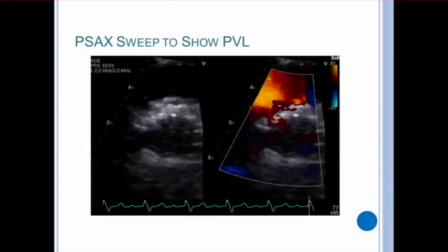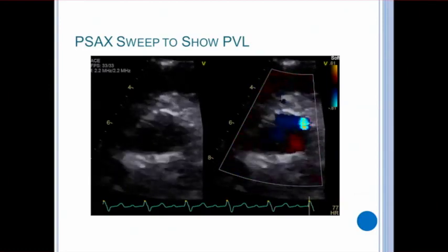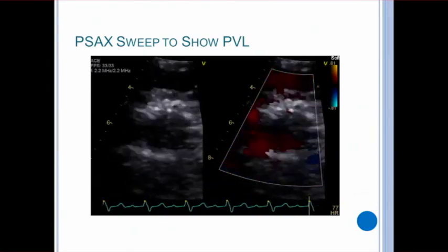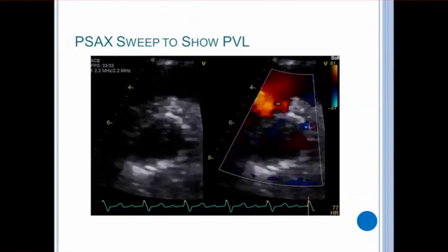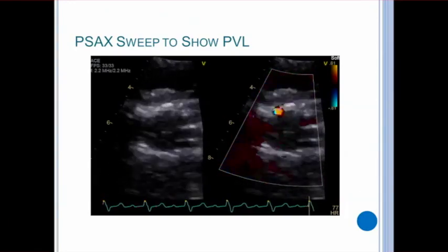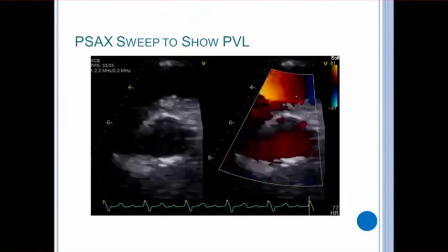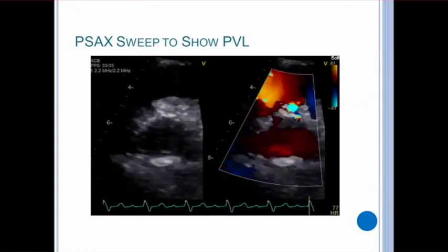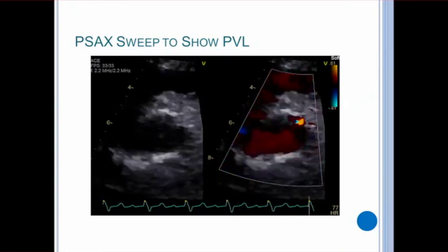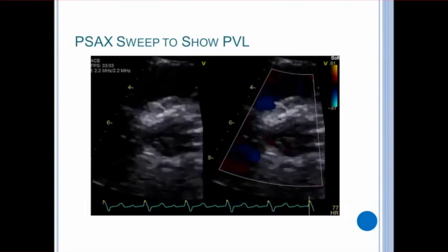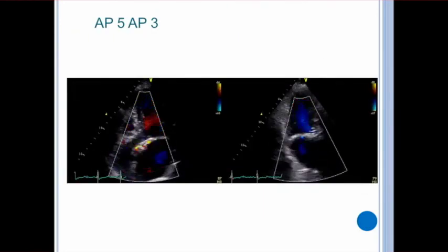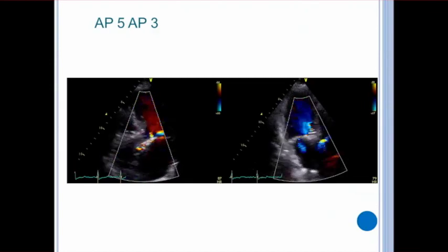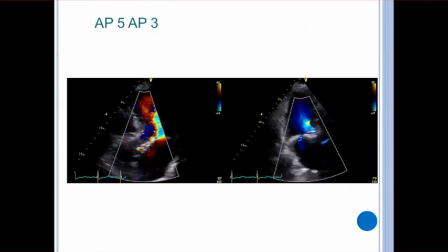The parasternal short axis view is crucial in assessing the number and severity of paravalvular jets. It's again important to sweep through the entire valve plane. In the short axis, the transducer should sweep superior to inferior, going above the valve and down through the LVOT. In this view, we can appreciate that there are multiple jets of regurgitation. The apical 5 and 3 chambers should also be used to interrogate for posterior paravalvular leaks.